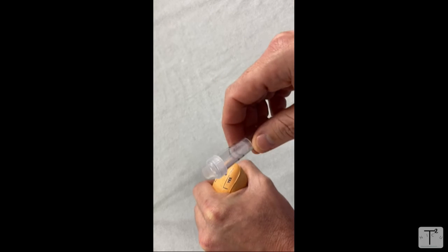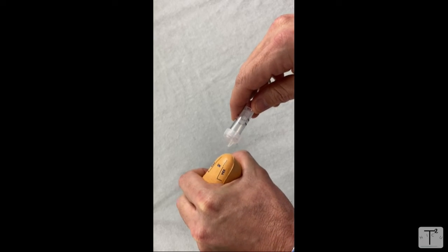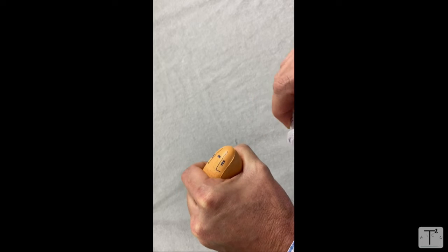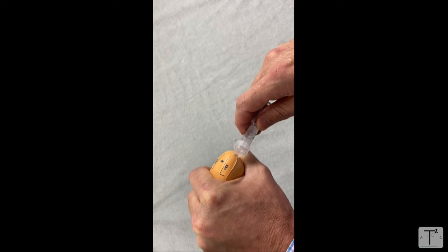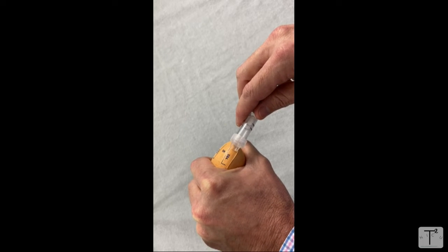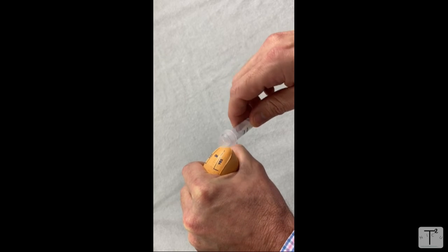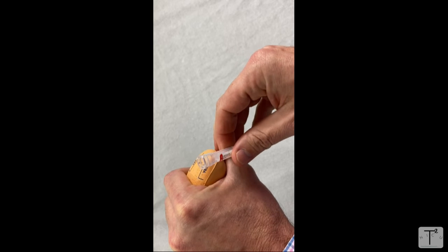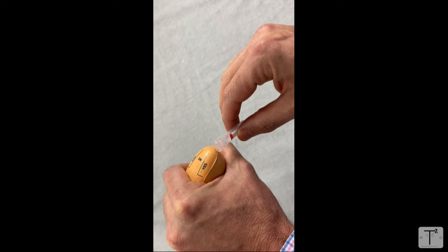I mentioned there being a scoop on the end of some lab vials. Here's an illustration of one that has a scoop. The tendency when you're in a hurry is to do this — you're squeezing and squeezing, occluding the capillaries. Do two squeezes, let the blood flow, and capture your drip. Don't scrape — remember, scraping could cause your potassium to be elevated, and it could cause your blood to clot quicker. Here's another vial that does not have the scoop — remember, every facility is different.